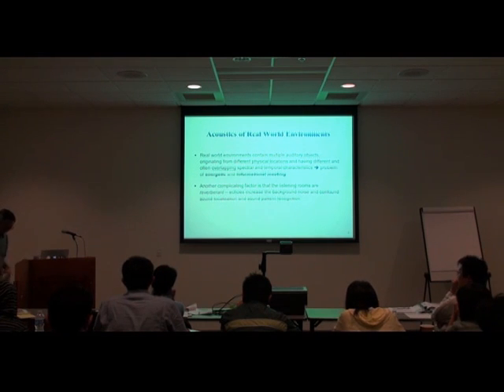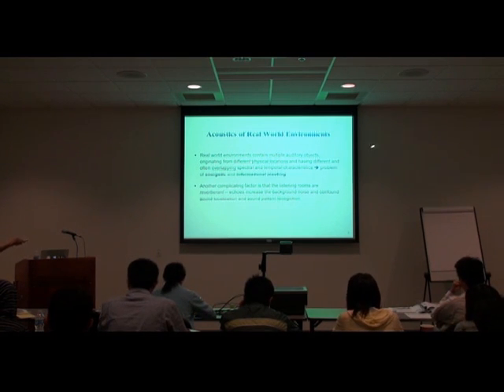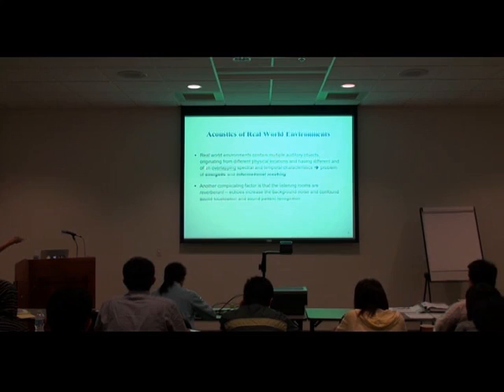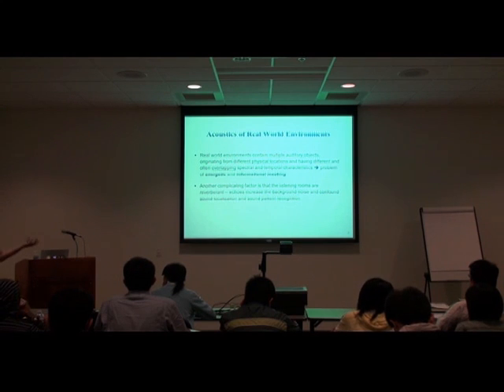The real situation in everyday living conditions often contains multiple auditory objects. So I'm talking here, and somebody is making noise, either you moving or somebody else talking, and the sounds originate from different physical locations, and they have very different, but sometimes also overlapping, spectral and temporal characteristics, right? When you're at a party, at a picnic, etc., people are talking, and speech masking is the real problem.